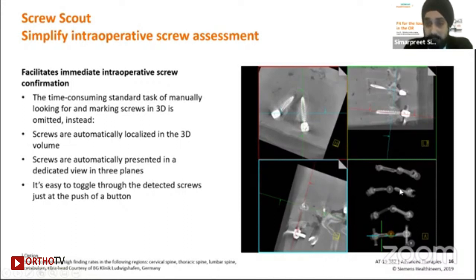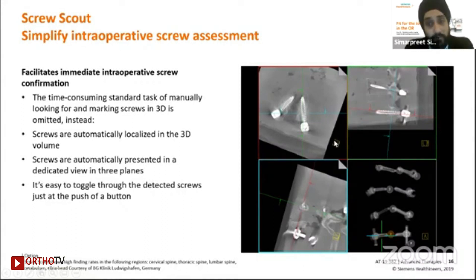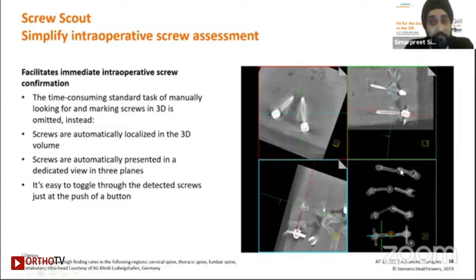For a multi-screw procedure — say eight or nine screws done on the spine — it becomes very challenging to individually align all three planes to check whether each screw has been implanted correctly. Doing this inside the OR would consume a lot of time. The system comes with new features that automatically detect all these screws and also automatically aligns the images for you. You simply go from one screw to another, and the system will automatically align the right plane and give you the result you need.